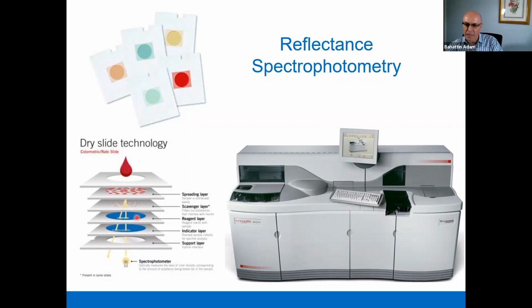It depends on the amount of the molecule that we are measuring, and the detector will measure the intensity of the light reflected from the test slides.